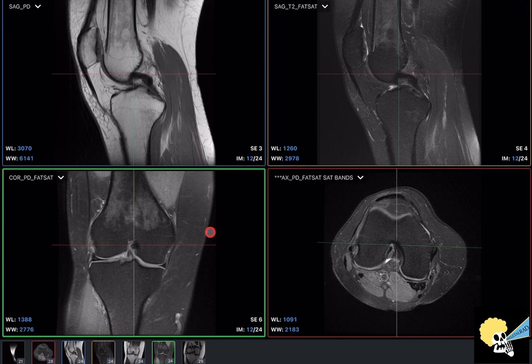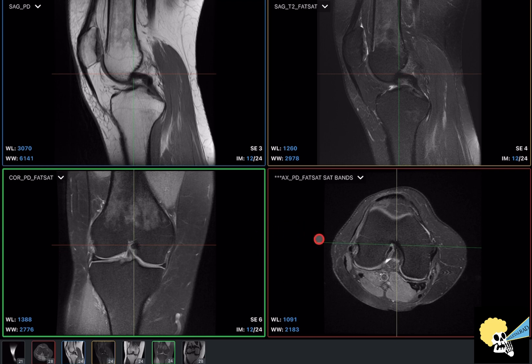The way I approach musculoskeletal MRIs is that I first evaluate the bones and joints, then the ligaments and tendons, and finally the soft tissues. In the knee, I add the menisci because they are really important to evaluate — a lot of people have meniscal tears, and that's the reason for knee pain. So I first evaluate the bone and joint, then the ligaments and tendons, then the menisci, and then the soft tissue.